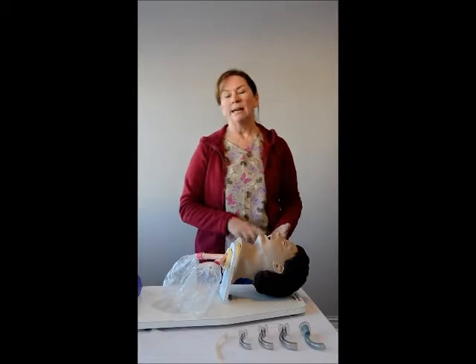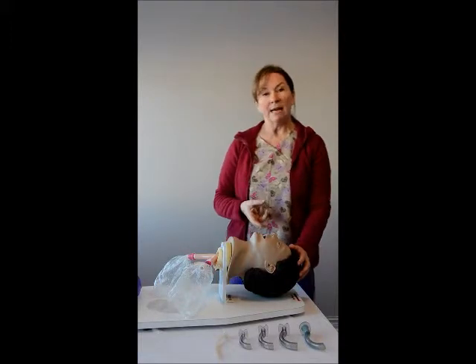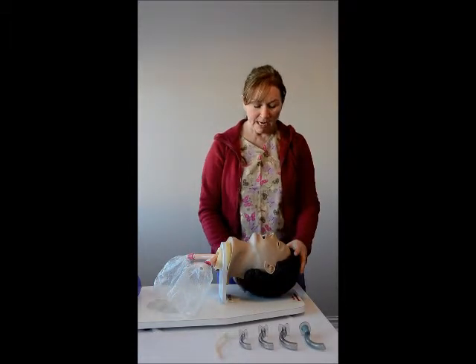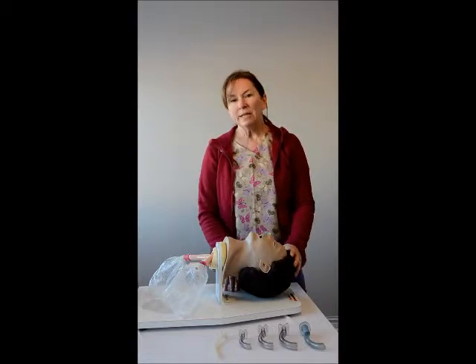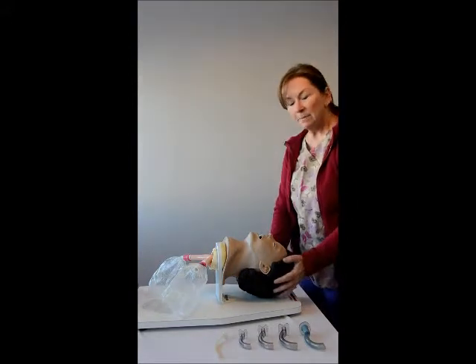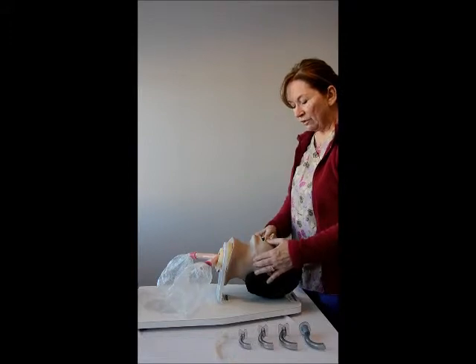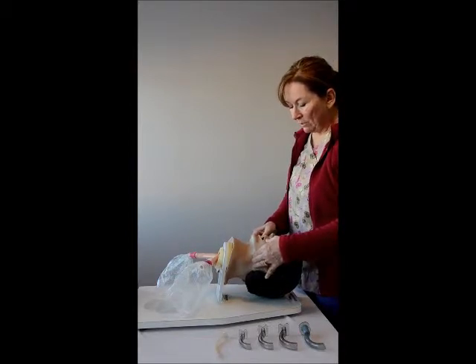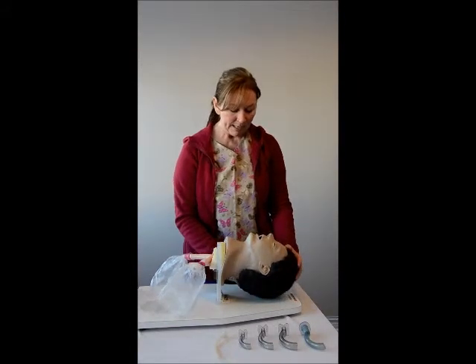The next things I assess are the airway and breathing. When checking the airway, I need to open it up to visualize any obstructions. Two ways to open the airway: if there's no suspected c-spine injury, I'll do a head tilt chin lift, which automatically takes the tongue out of the airway — it's usually the tongue that causes obstruction. If there is a c-spine precaution, I cannot do the head tilt chin lift; instead I perform a jaw thrust maneuver, going to the junction of the mandibular angle and lifting the lower jaw up to take the tongue out of the way. My airway is patent and I see no obstruction.